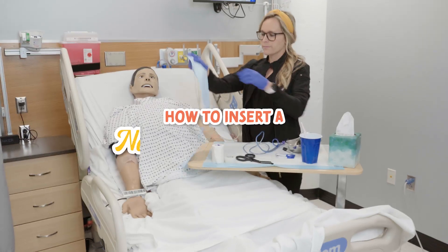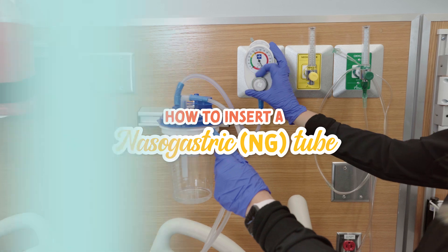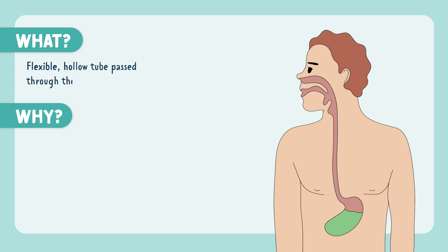Let's walk through how to insert a nasogastric tube, also called an NG tube. An NG tube is a flexible, hollow tube passed through the nose into the stomach.